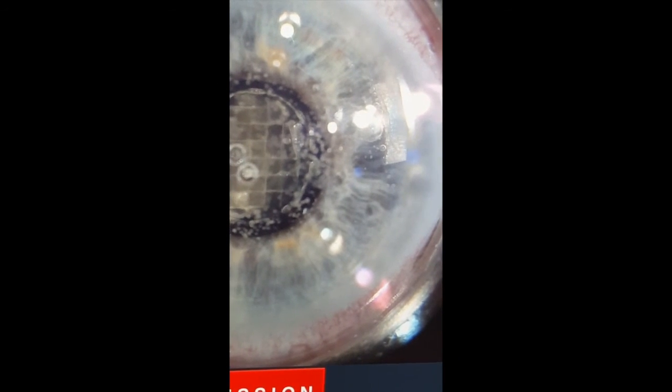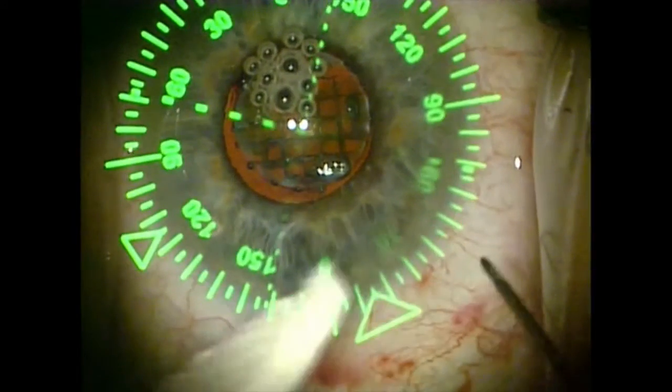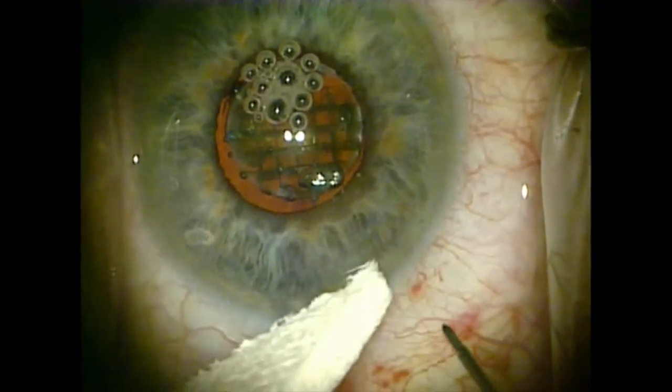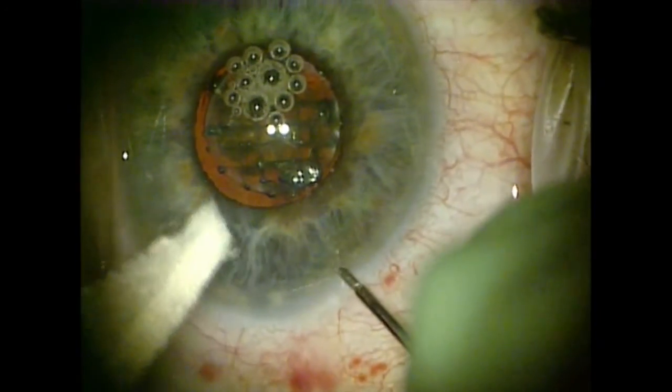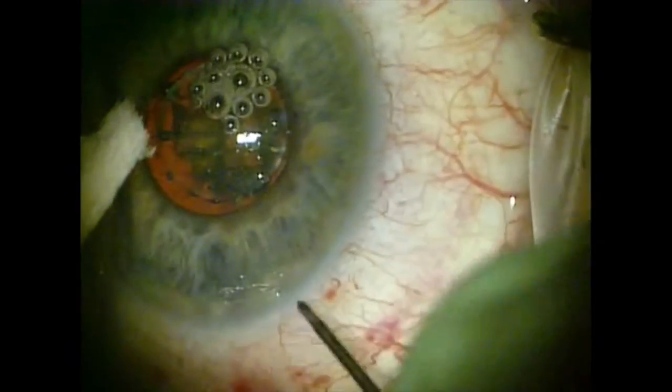And here's the actual lasering, and it winds up being just a little bit, maybe 1 to 2 millimeters more anterior than I would have liked it. So again, just move those incisions back until the middle portion of the cornea is white or opaque.